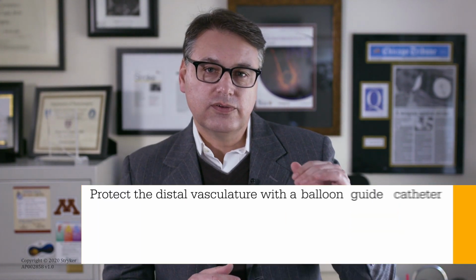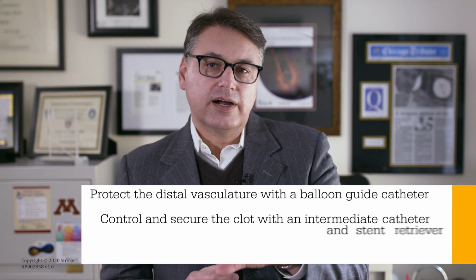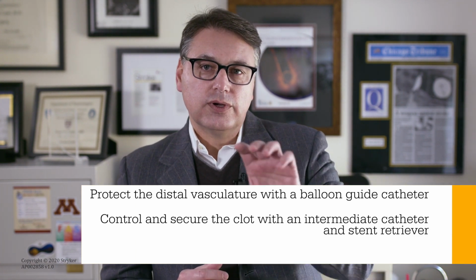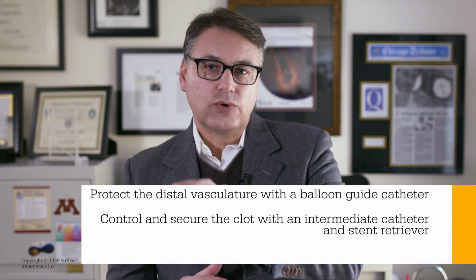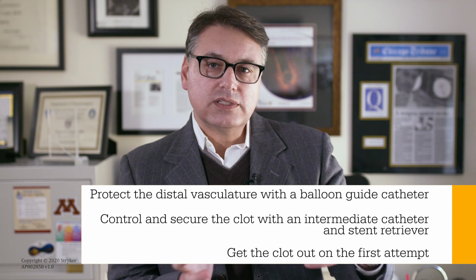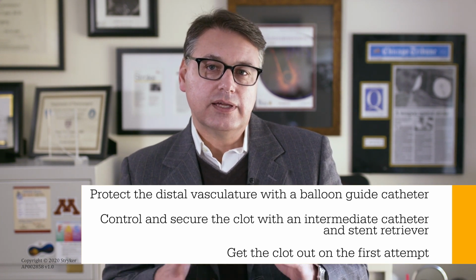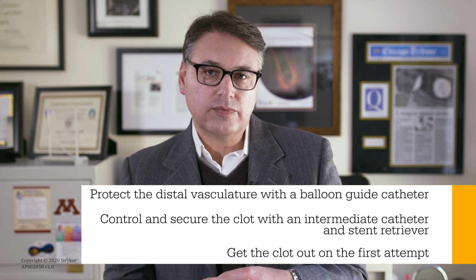First of all, you've got to have flow reversal and control the flow. Second involves the ability to control the clot or trap the clot. And then the third is the execution, to be able to do a single pass and remove the clot with the cleanest type of revascularization, a TICI 3. The more often you can do that, the better; that is perhaps the ideal type of mechanical thrombectomy technique.